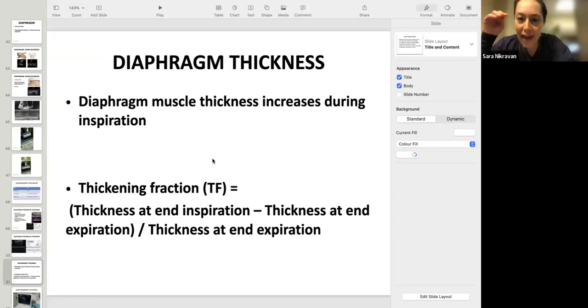And I would just say that it is normal to have sometimes a little bit of air and water. So you may see 1 or 2 B lines in a normal patient, maybe. But like Kapil said, if you see 3 or more, then that's abnormal within a field. And a field is described as between 2 rib spaces.